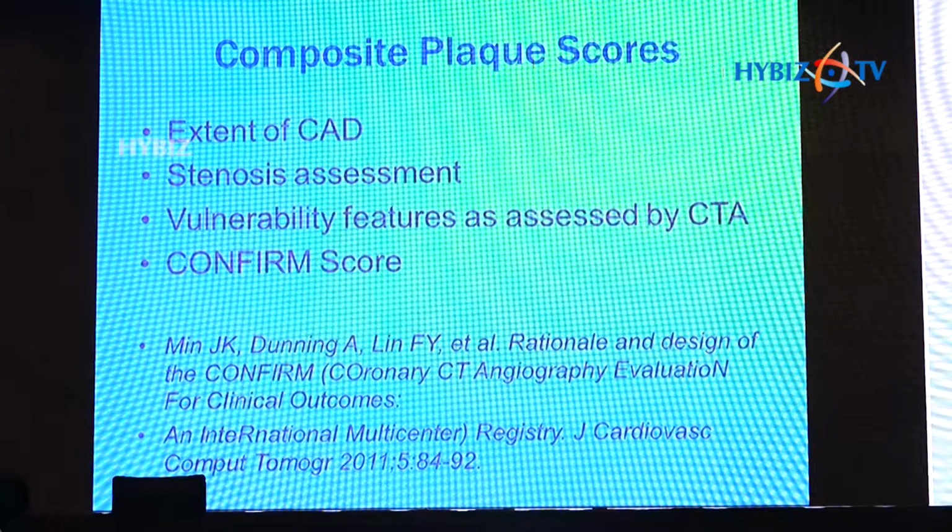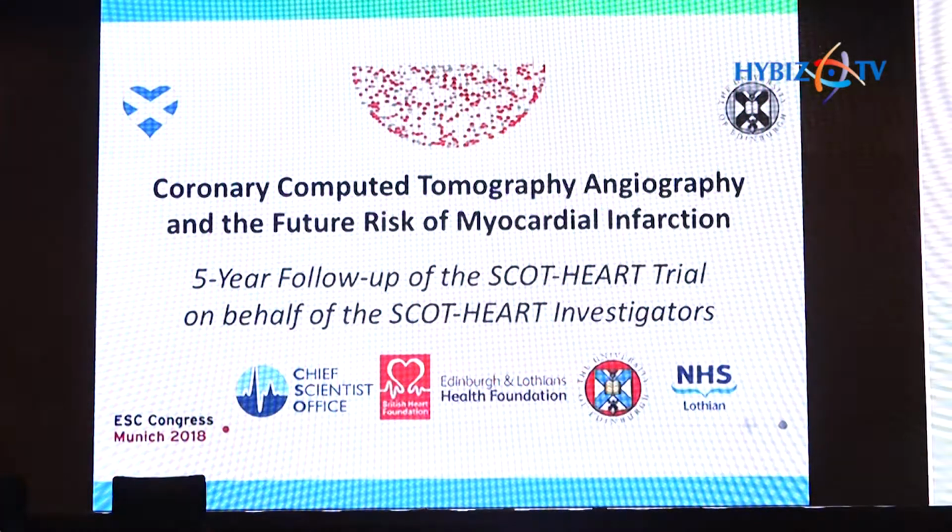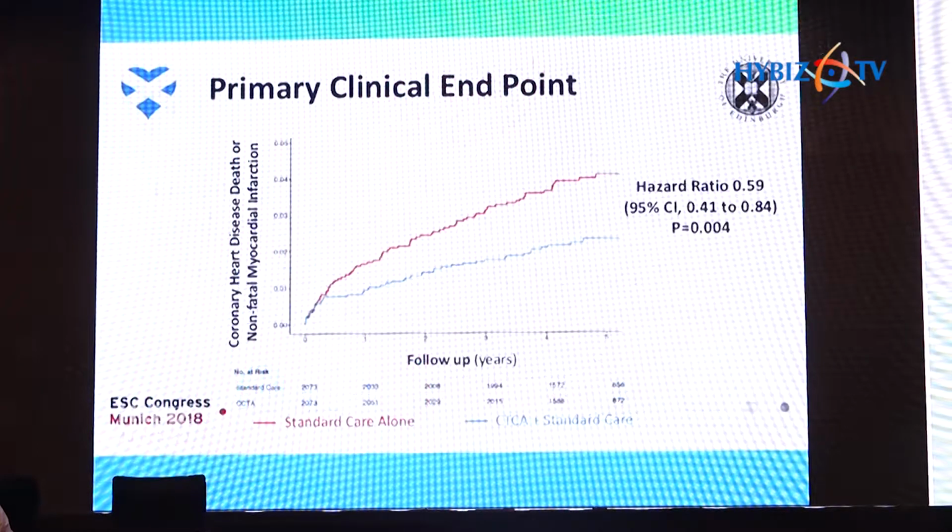So ladies and gentlemen, I think a comprehensive assessment on CT will be able to identify a vulnerable plaque and also a vulnerable patient. The SCOT-HEART trial, which was recently published, clearly showed that if you used a CT apart from standard care, you actually are able to predict which patient has events and which doesn't.